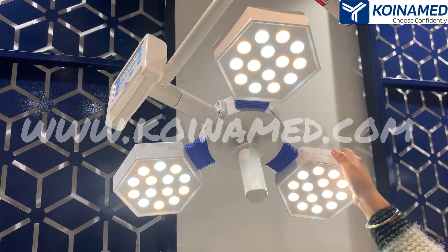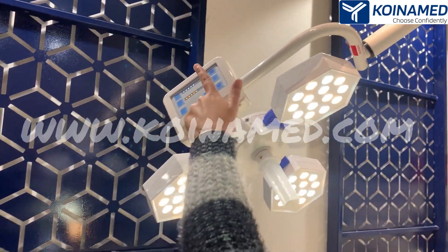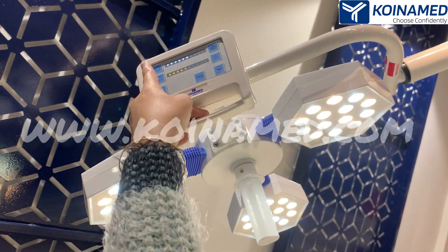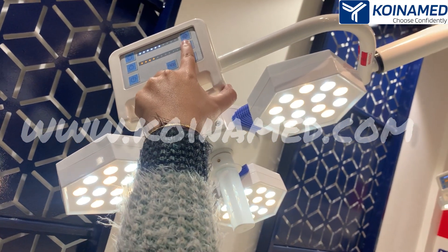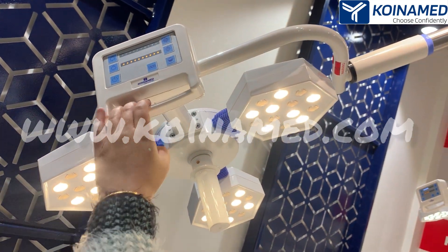Now I will show you the feature of this capacitive touch controller. From here you can increase the white LEDs brightness and from here you can decrease it. From here you can decrease the yellow LEDs brightness and from here you can increase the yellow ones. This is the power on and off button.